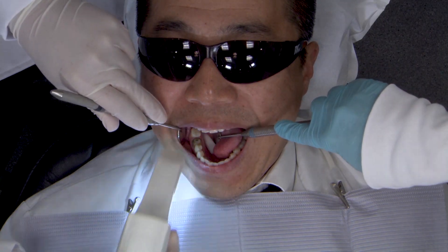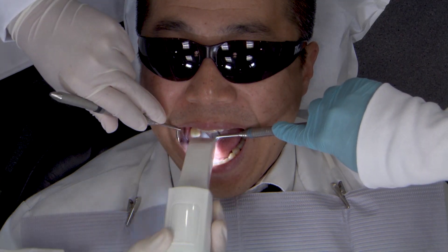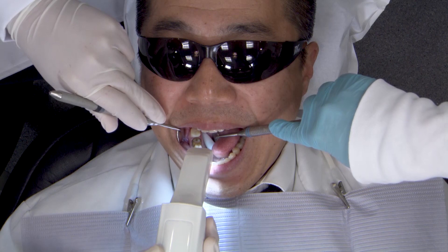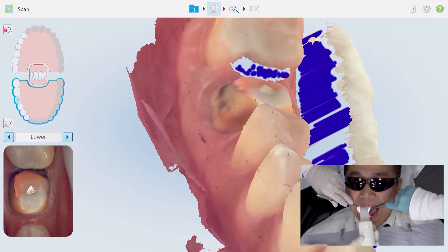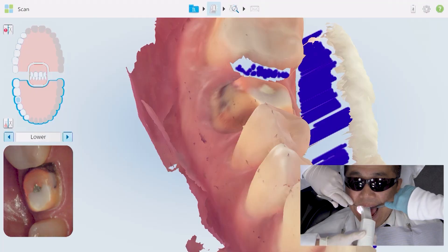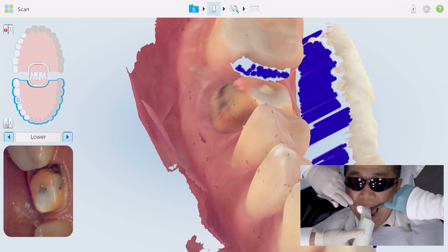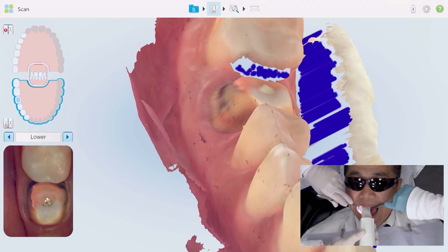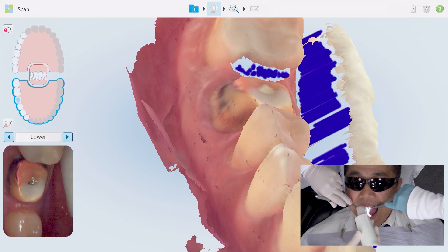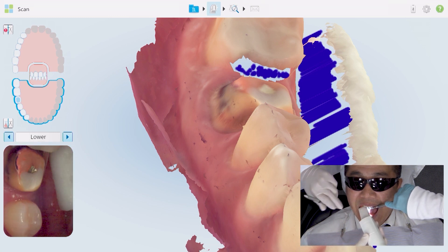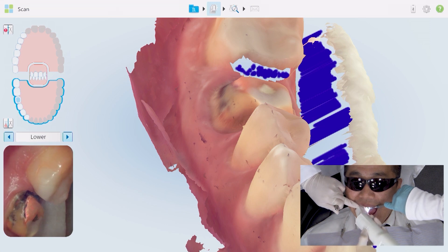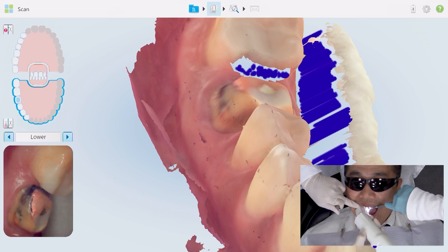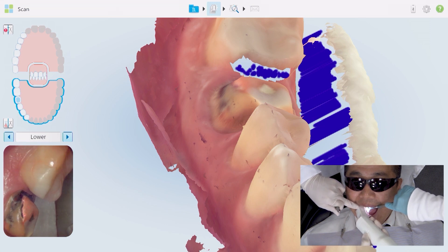I have the help of Ileana, who's going to keep the tongue retracted. Now it's all about positioning. During the initial rotation to the lingual — on that live view on the lower left-hand corner — rotation to lingual and rotation to the buccal, you can see it's really hard to visualize that undercut, that mesial surface of 31.